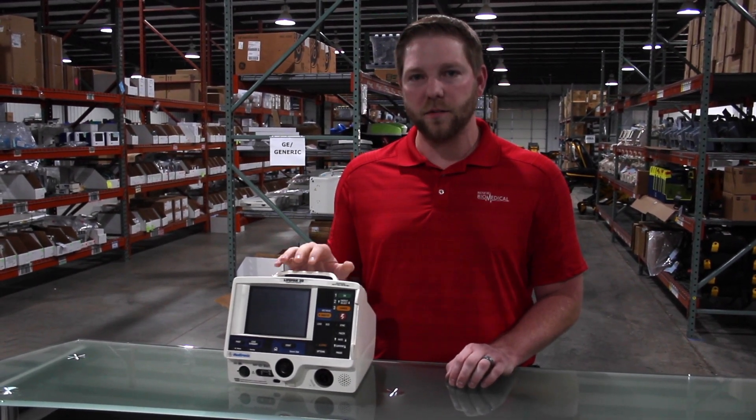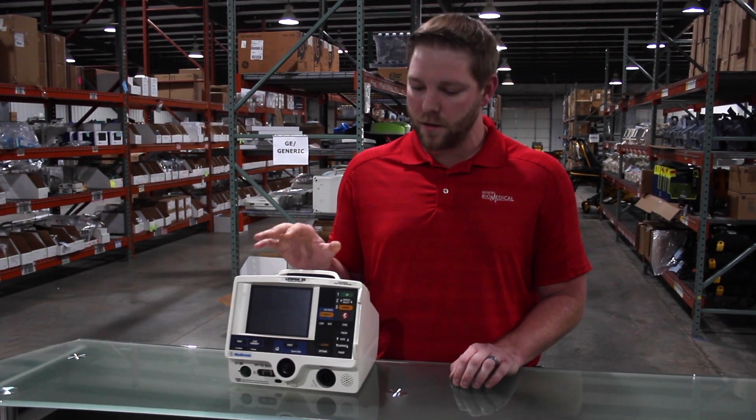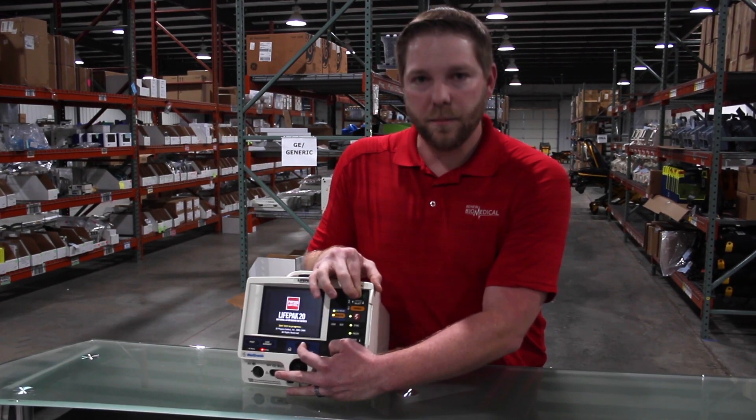First thing you need to do is verify the unit is unplugged. You want to test all settings on battery mode only. Once that's done, you power the unit on. To go into service mode, you hold down Event and Options at the same time and power the unit on.